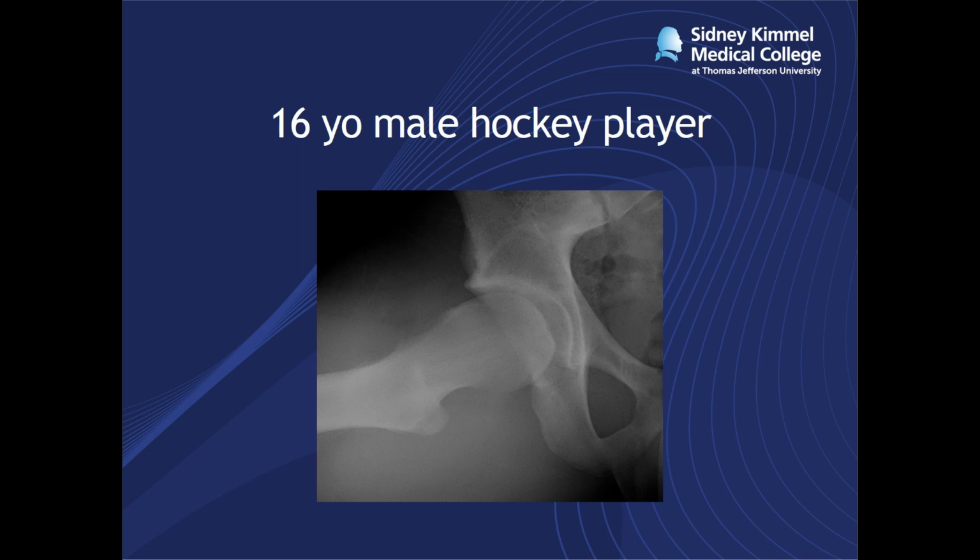One of the side benefits of doing an arthrogram is that you can give a little intra-articular lidocaine and go through some passive range of motion through the impingement arc and just see whether there's a change at the beginning and at the end of the procedure. This patient was pretty uncomfortable in the beginning, maybe 6 or 7 out of 10 with going through the impingement arc before we gave intra-articular lidocaine, and then had almost near complete relief afterwards. So this strongly suggests that the majority of the pain is coming from something inside the joint.